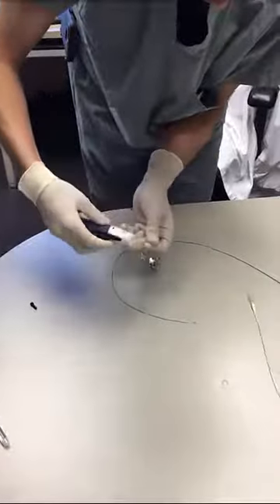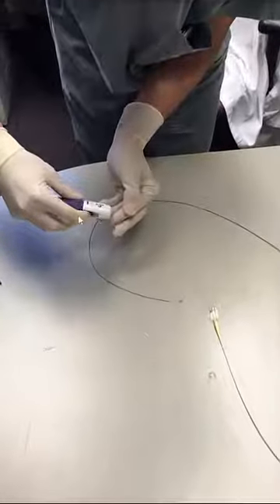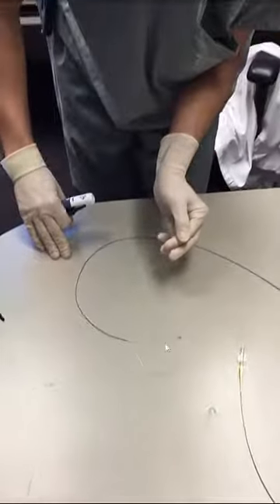Once we're satisfied, then we get this specialized release device. We pull back the trigger and what that does, it releases the distal part of the coil.